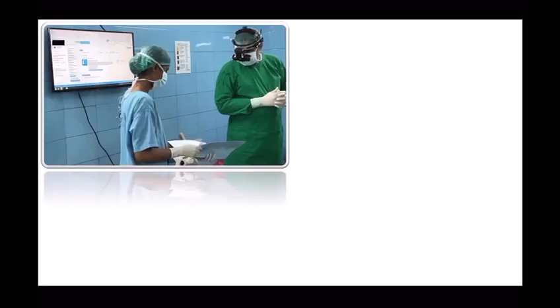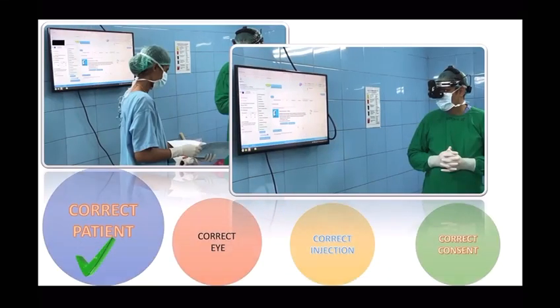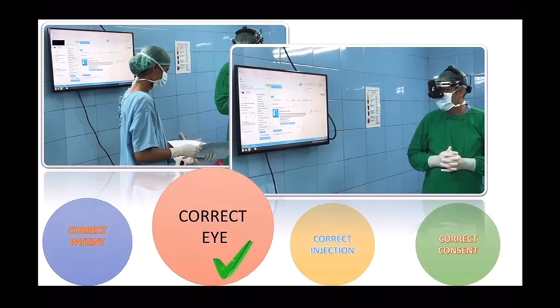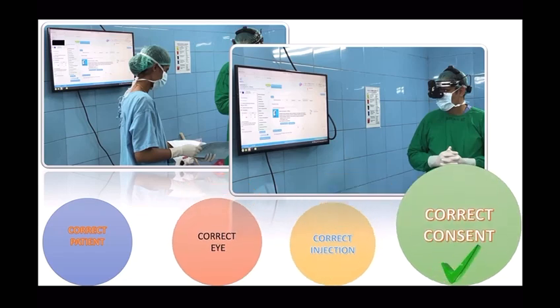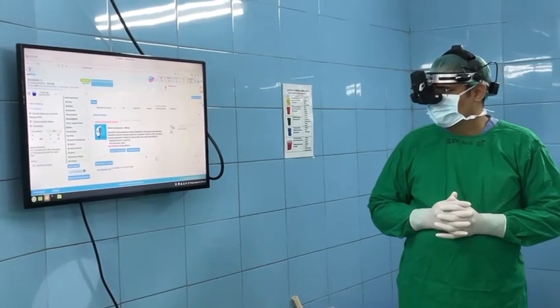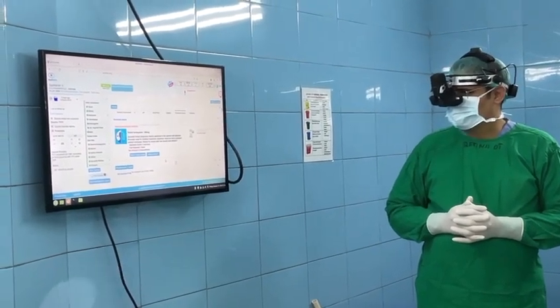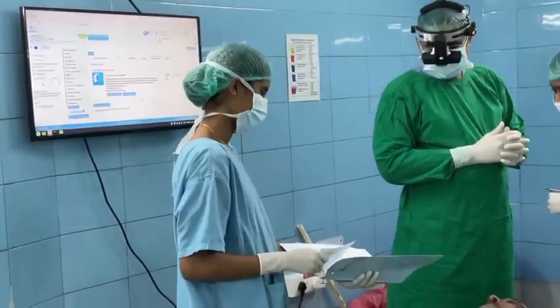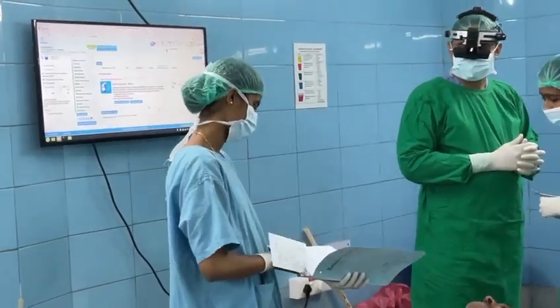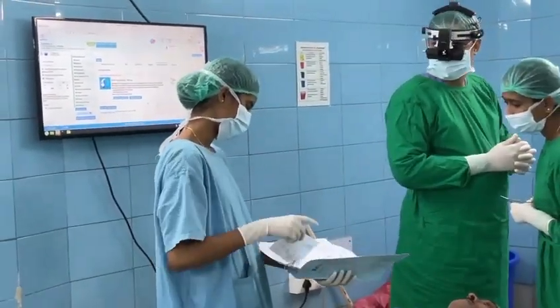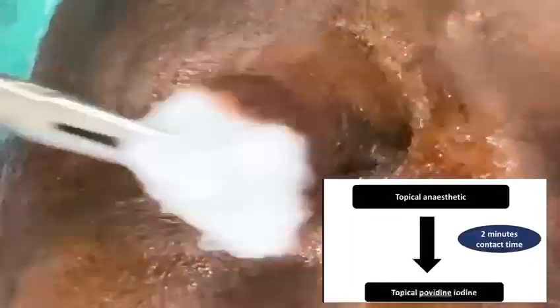In the operation theater, 4C are confirmed: correct patient, correct eye, correct injection, and correct consent. Patient's record is projected on a big screen, making it easier for the doctor to verify the details without leaving the sterile zone.